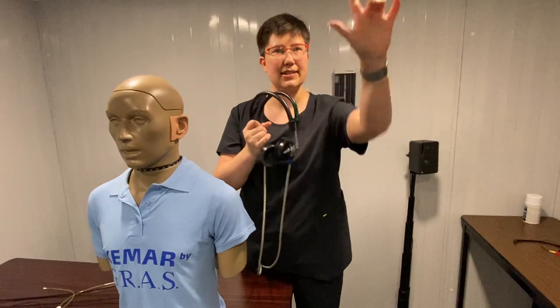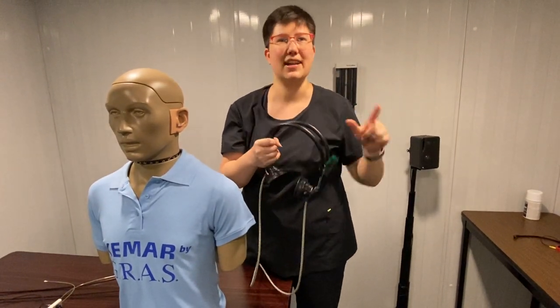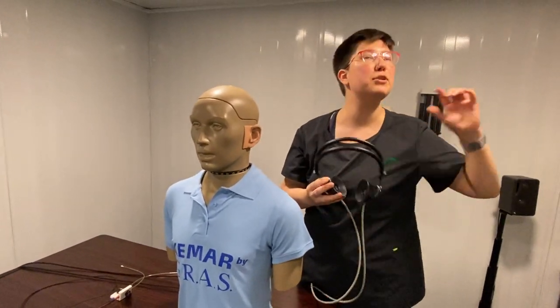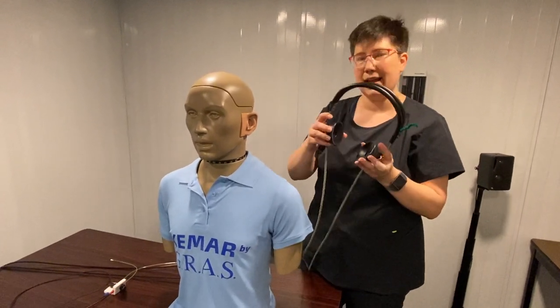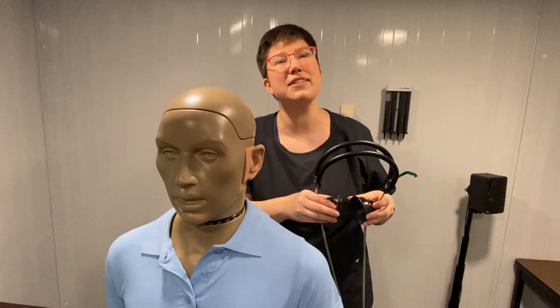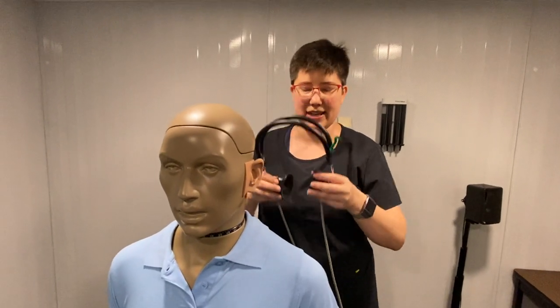The left hand holds the blue — left. Red right, blue left. Republican red, Democrat blue — I'm still not asking about your politics. Mine's red, right, round; whatever's left over is blue. Whatever helps you remember. Things that don't offend people don't get remembered as well, but just mildly.